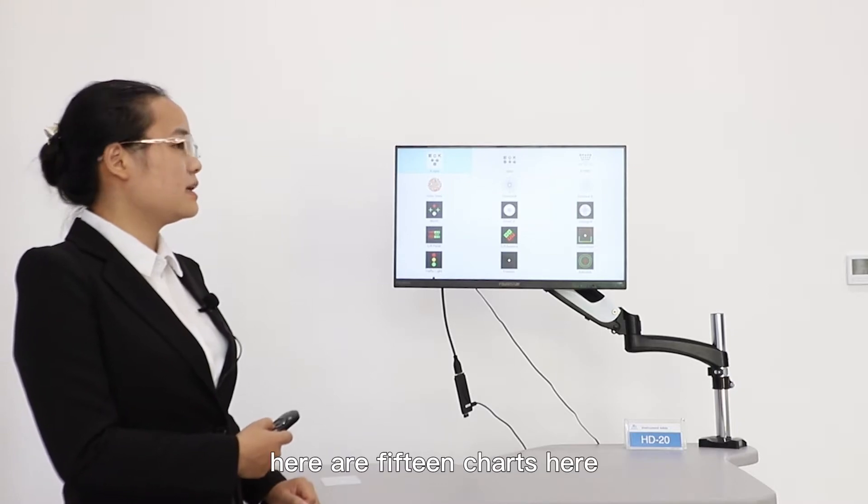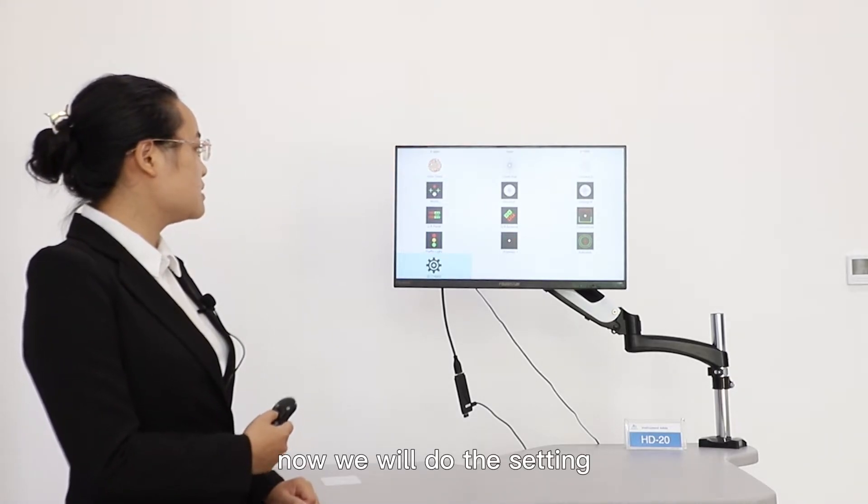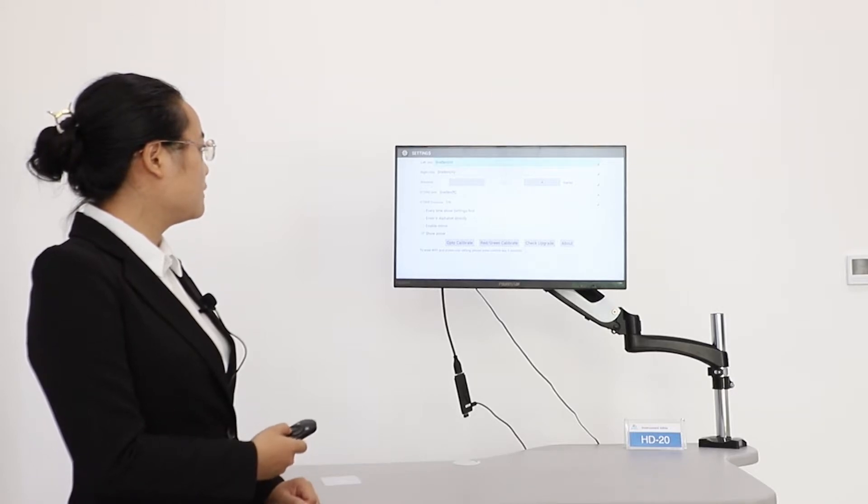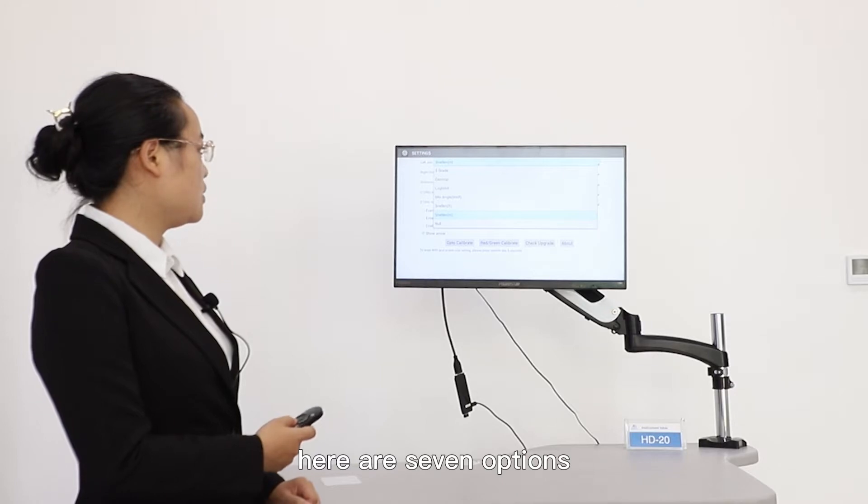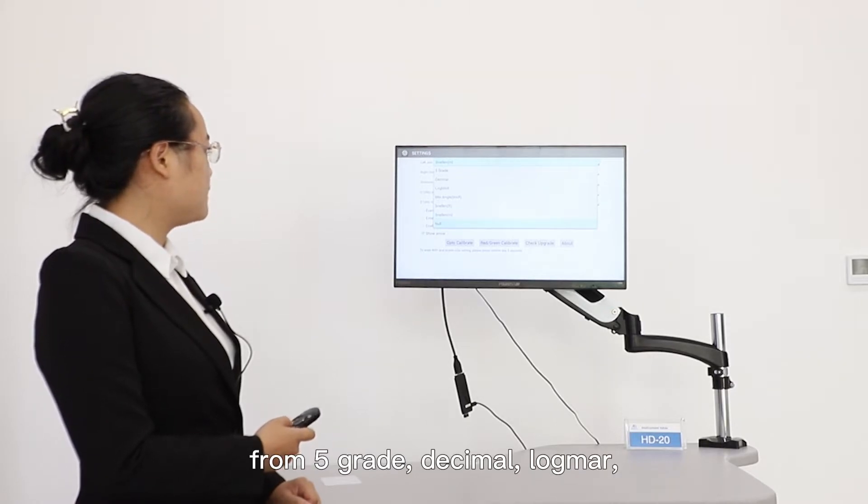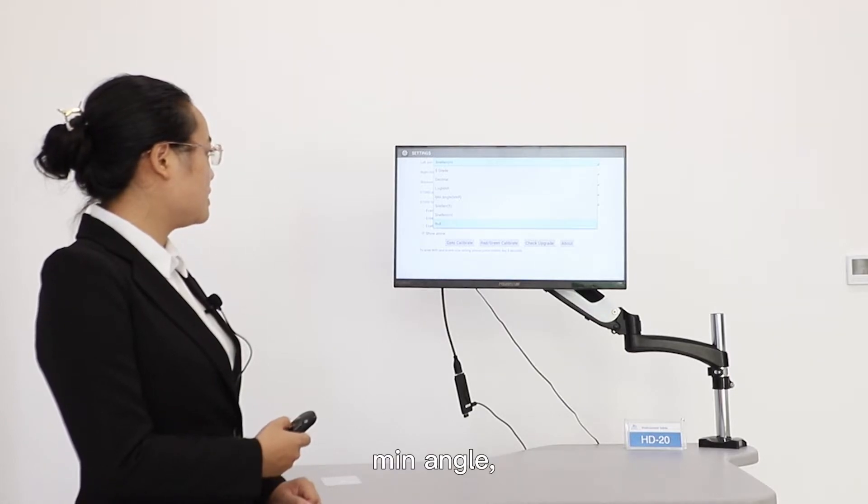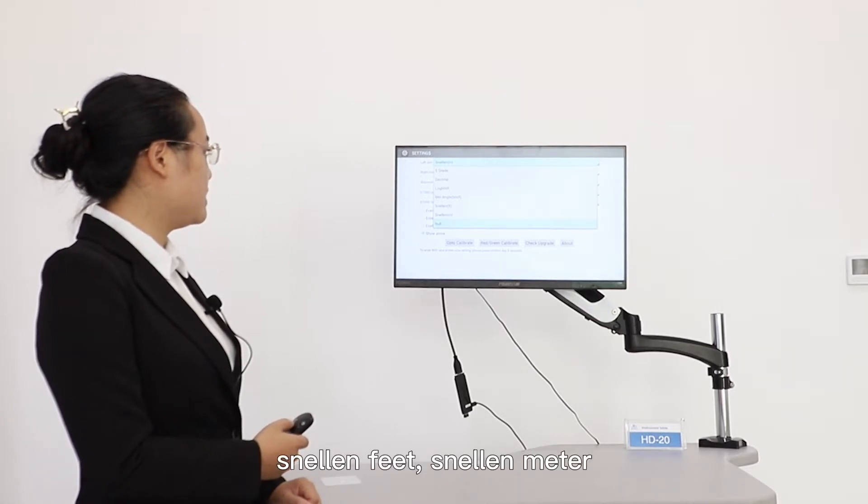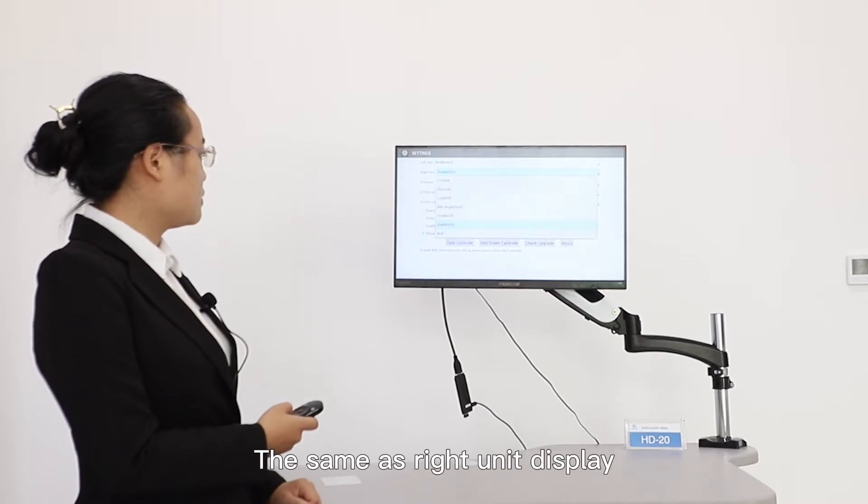As you can see, there are 15 charts here. Now we will do the settings. For left unit display, here are seven options: five grade, decimal, logMAR, min angle, Snellen feet, Snellen meters. It's the same as right unit display.